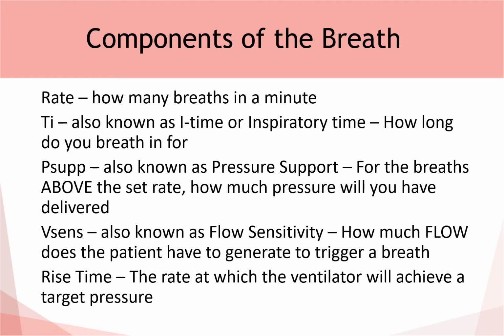So let's talk about the components of the breath one more time. The rate refers to how many times a patient breathes in 1 minute, how many breaths are delivered in that minute. It's important to remember that this rate is dialed in on the ventilator generally, and it is the minimum number of breaths that the patient takes. If the patient wishes to take more, there's generally an arm of ventilator management that reflects what support those additional breaths on top will get. The TI is also known as the inspiratory time. It dictates how long a patient will breathe in for.